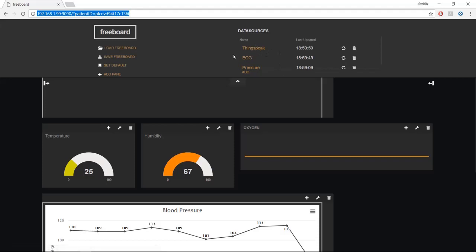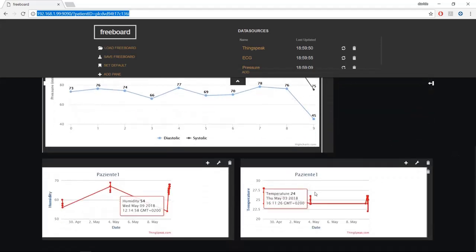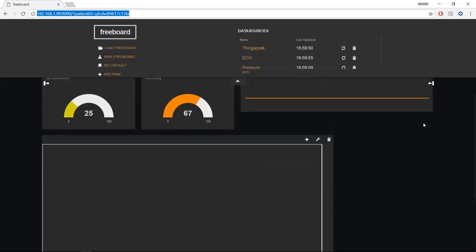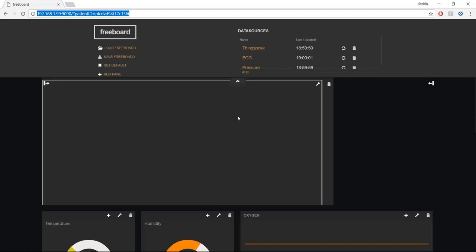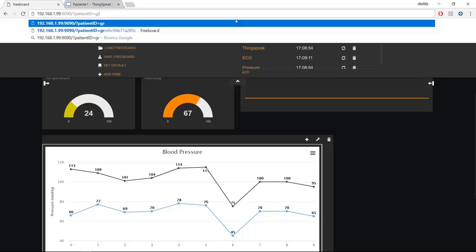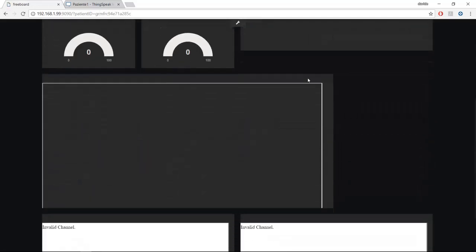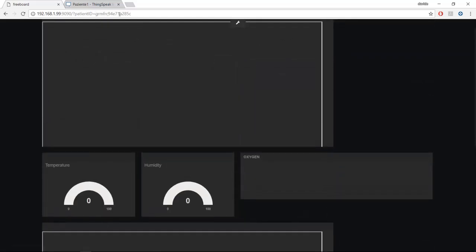ThingSpeak is useful to retrieve information about temperature, humidity, oxygen, and at the same time these 2 charts, which are directly taken from ThingSpeak. Instead, here we have the first chart with blood pressure and another chart that we are not seeing yet. Now we will see what the Freeboard dashboard returns when you look for another patient. This patient is present in the catalog, but we have not created his ThingSpeak channel. At the same time, there is no Arduino sending ECG with a topic related to this patient. For this reason, you will not find anything when Freeboard asks for resources.